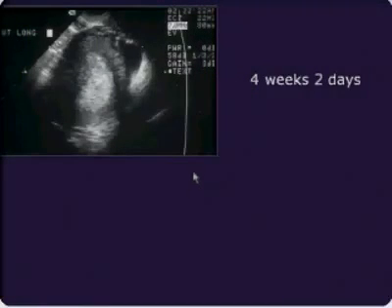All right, let's look at a normal pregnancy develop here. This woman comes into the emergency room and she's having some abdominal pain. HCG is positive. She has barely missed her period. Okay, 4 weeks. Now notice the time, it's 2:22 a.m. because no one comes ever in for rule-out ectopic during the day. They all come in the middle of the night.